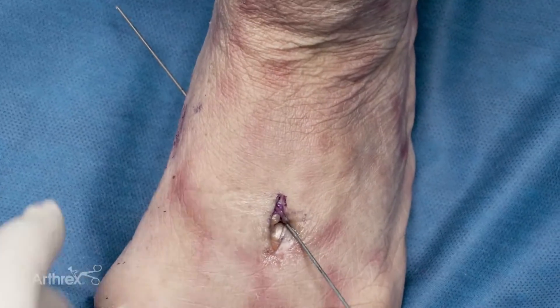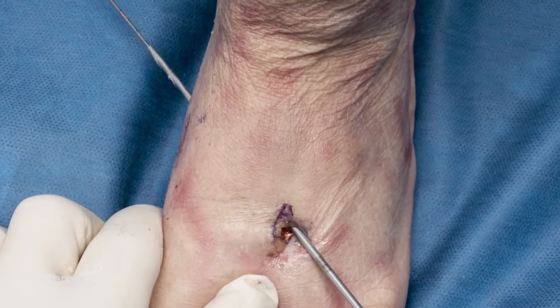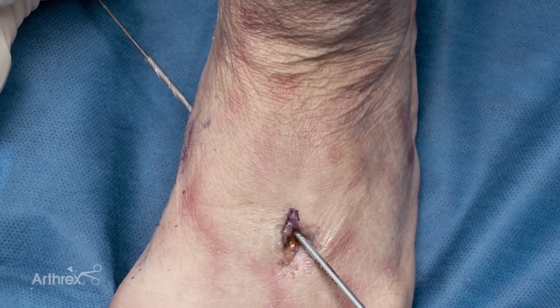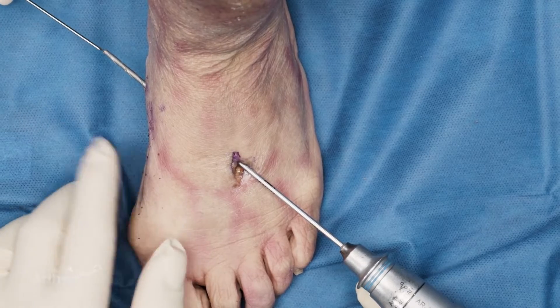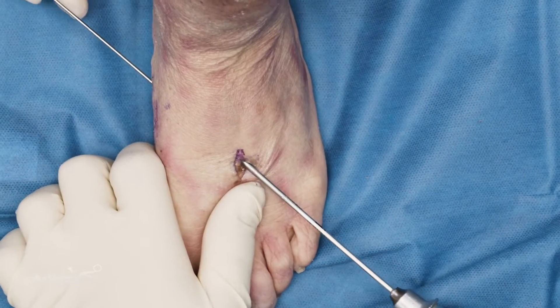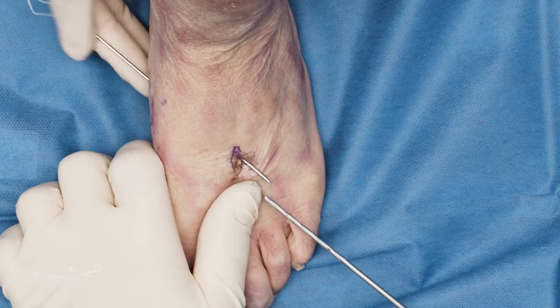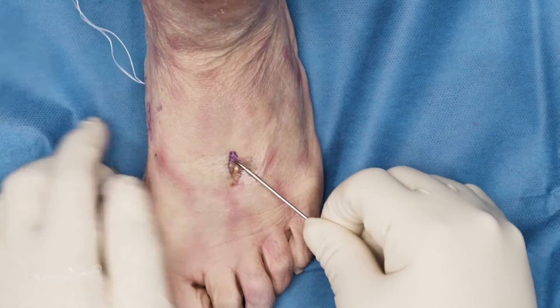I'm going to take my 2.7 drill and drill through the base of the second metatarsal and out through the medial cuneiform, then remove my pin. The nice thing you can do is take the tip of your mini tightrope — as I slide it back, I'm being pushed out by the pin. It's a nice way so you don't lose your hole and you're not struggling.